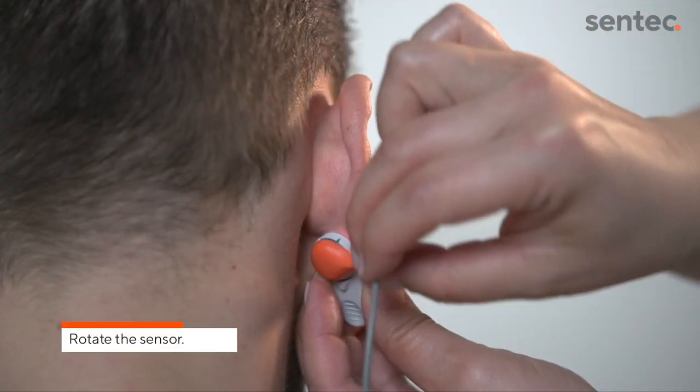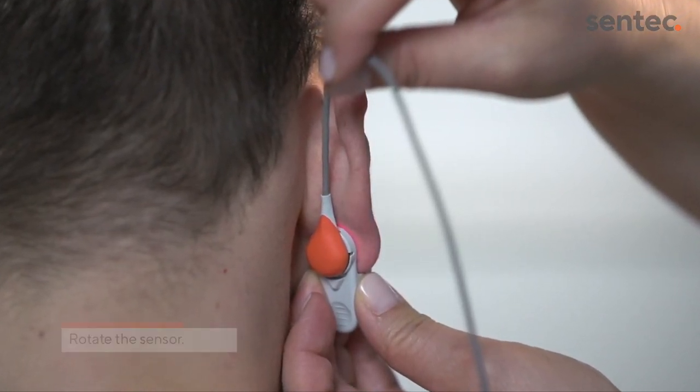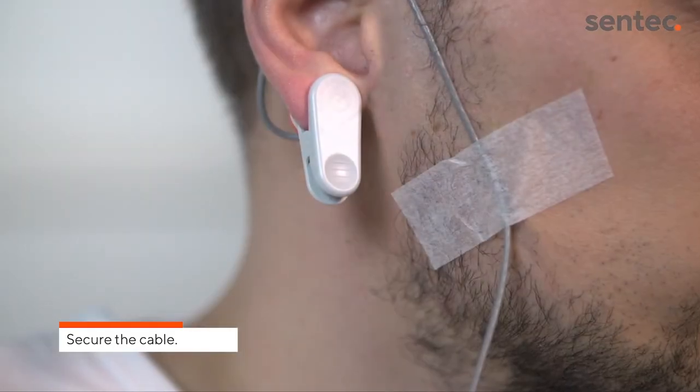Rotate the sensor such that the cable points to the crown of the head. Wrap the sensor cable around the ear and tape the cable to the cheek.